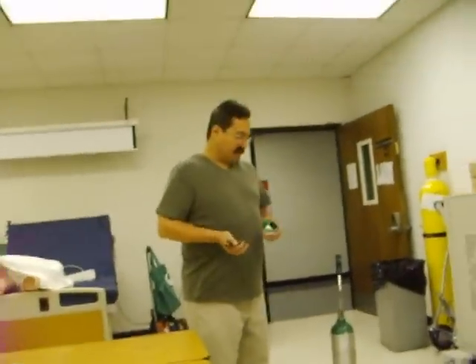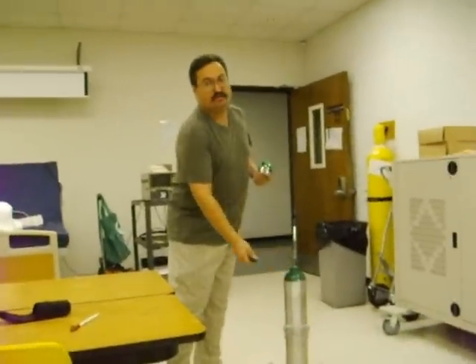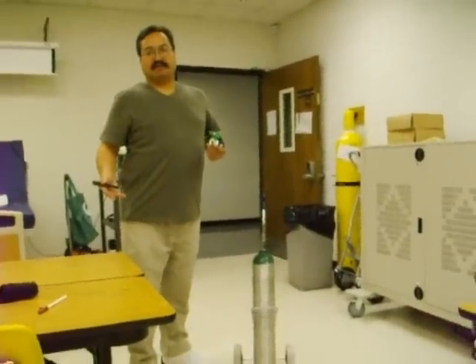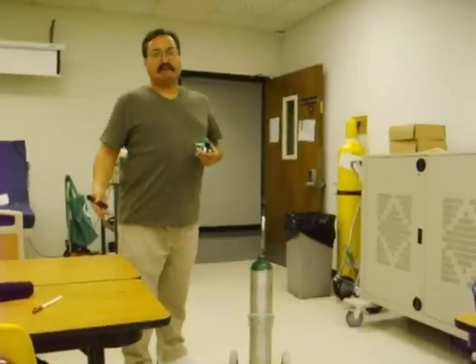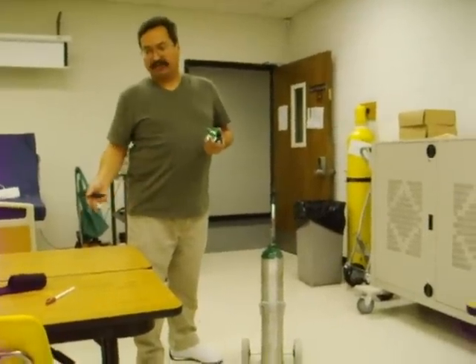We're getting ready to transport a patient, and we've got a full cylinder here, which we know will last us 10 hours at about 1 liter per minute, or 1 hour at 10 liters per minute, following our general rule of thumb.